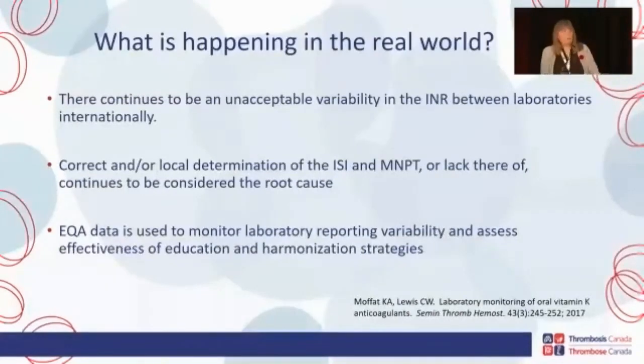So what is happening in the real world? Because the INR was brought in to be this international standardization for your warfarin monitoring of your patients. We continue, Dr. Lewis and I published a review article in 2017 that there continues to be unacceptable variability in the INR between laboratories internationally. And the main or the root cause of this variability is that laboratories setting the ISI and the mean normal prothrombin time, or the denominator of that PT ratio, is still variable and is not well done internationally.